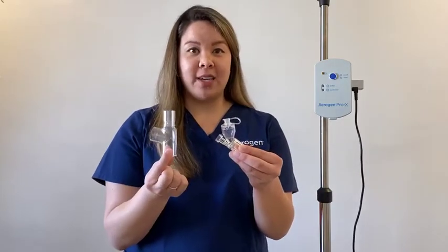If Aerogen technology is integrated into your ventilator, you will just need to gather the Aerogen Solo and the Aerogen Adult T-piece. If Aerogen is not integrated into your ventilator, you will also need to gather the Aerogen Pro-X controller, the AC-DC power cable, and the controller cable.